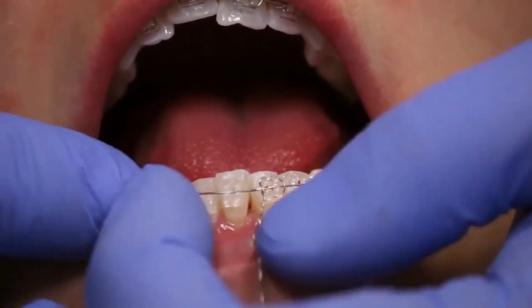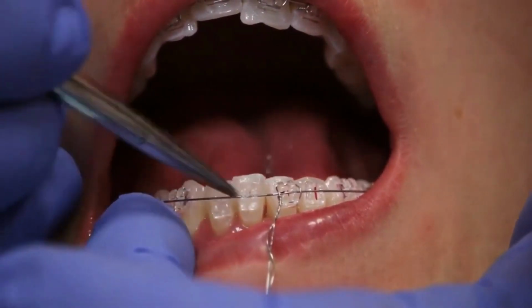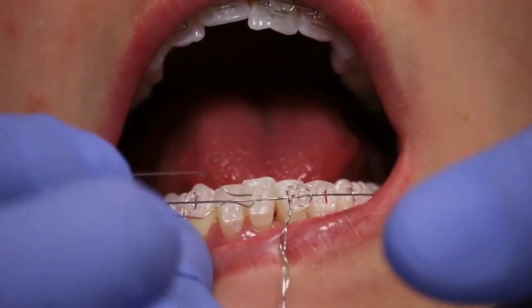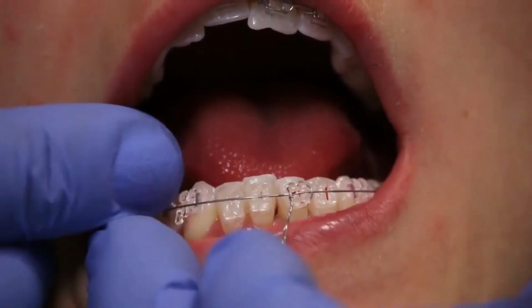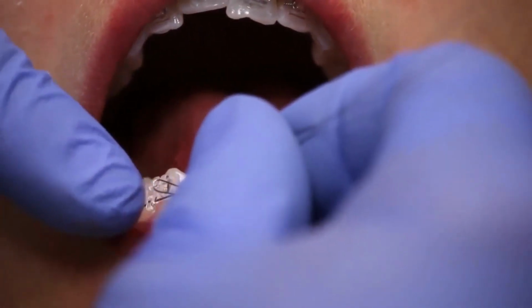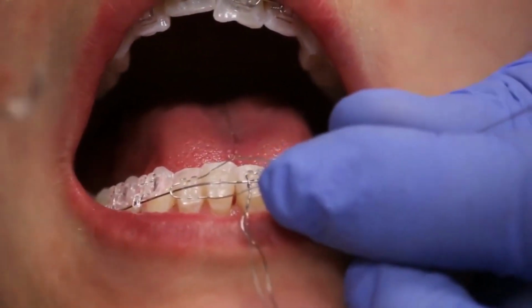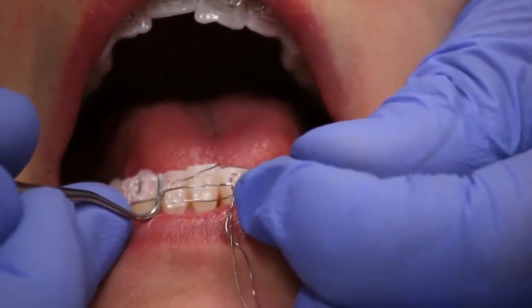So on this side, you can see that the lateral incisor, it's a little behind. So if I tie the lateral and then the canine, I will have less wire flexibility. So at this time, I'm gonna go and tie that lateral incisor. Since the tooth also has a mesial rotation, I will place my pigtail towards the mesial, where there is more deflection of the wire. The pigtail is placed towards the mesial with the objective of having the tightest part of the tie towards the rotation.